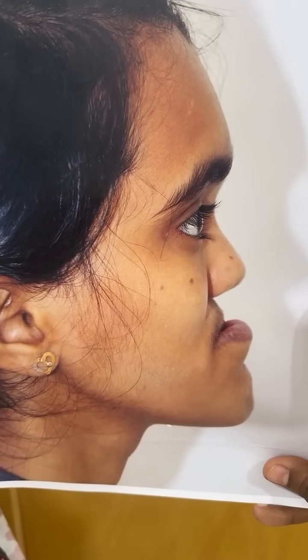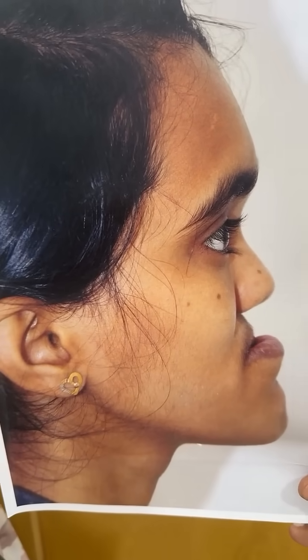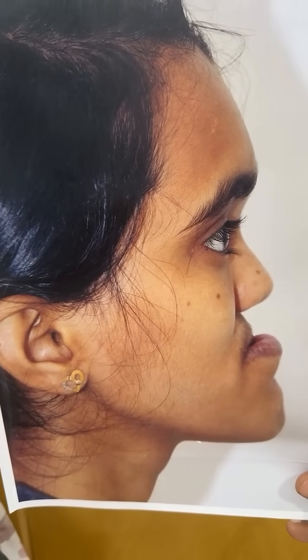You're seeing a patient who has a severe problem in the upper jaw. The lower jaw is a little bit overgrown, but the upper jaw has not grown at all — she has very severe maxillary hypoplasia. This is her now, two weeks after we have grown new bone on the upper jaw by means of distraction osteogenesis.